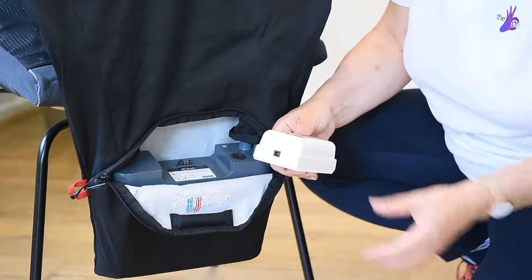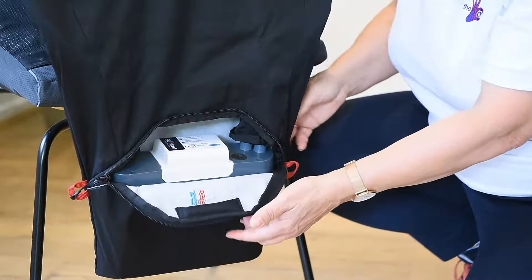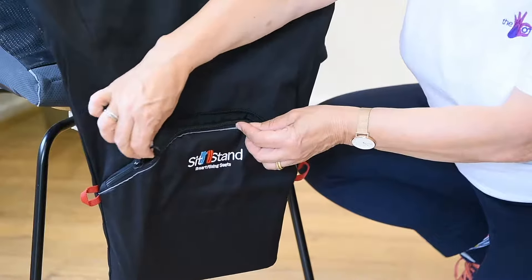Due to the magnet in the battery, it slips easily back into position following charging and can be zipped up and hidden away.